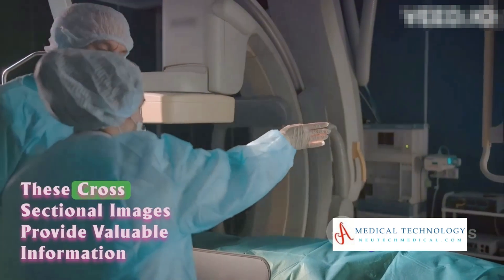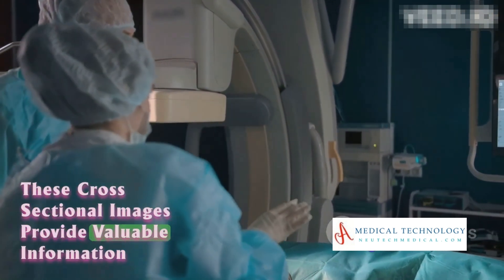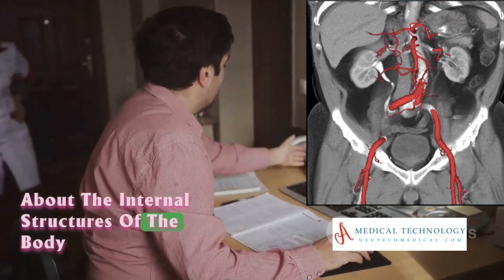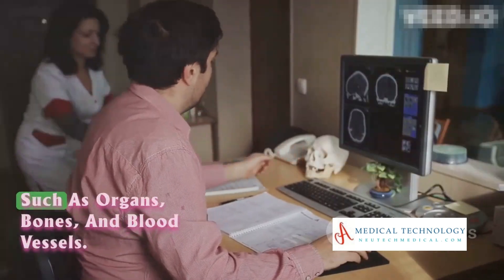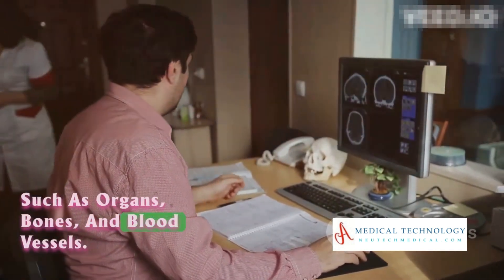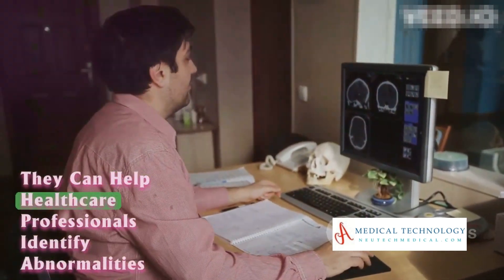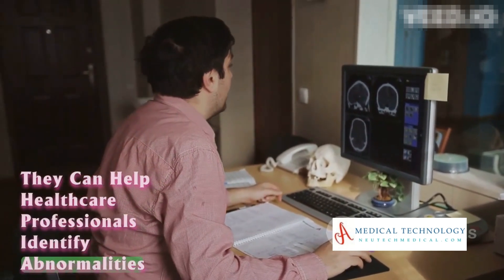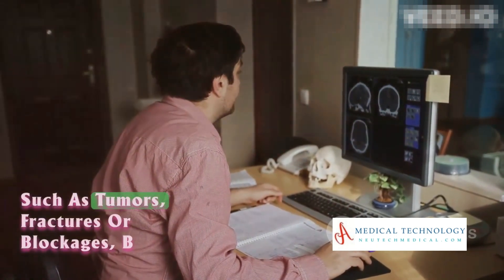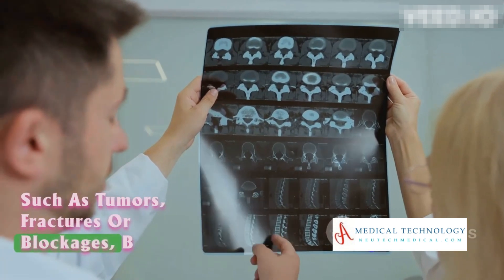These cross-sectional images provide valuable information about the internal structures of the body, such as organs, bones, and blood vessels. They can help healthcare professionals identify abnormalities, such as tumors, fractures, or blockages.